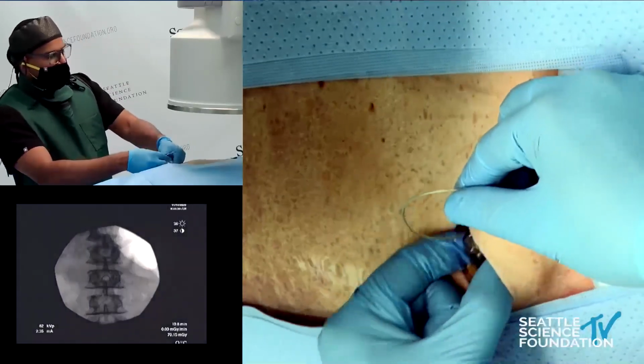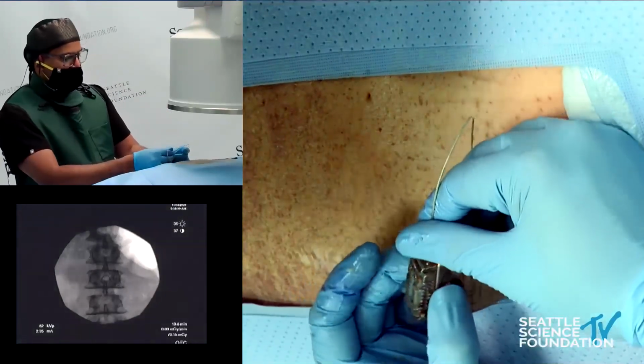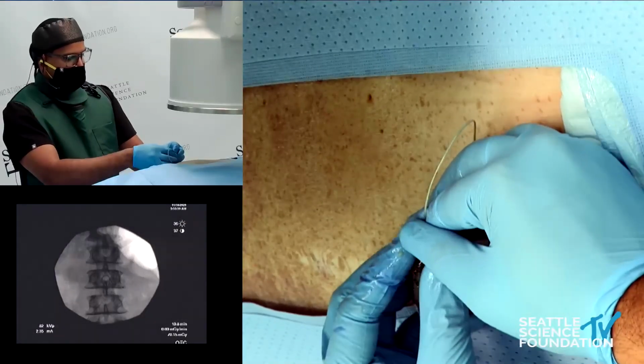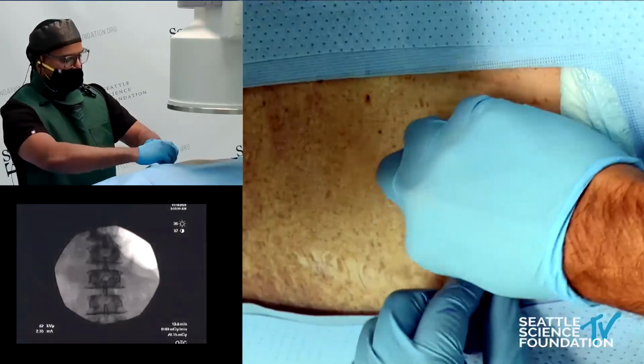I think for the sake of time, I will just show you that we just place it in. These are not unscrewed, but you'll put it into the IPG ports. You'll screw down, you'll check impedances with the reps, and they say everything looks good. You'll put it in, they'll check impedances again, and if all that looks good, you're set to go. You can irrigate and close.